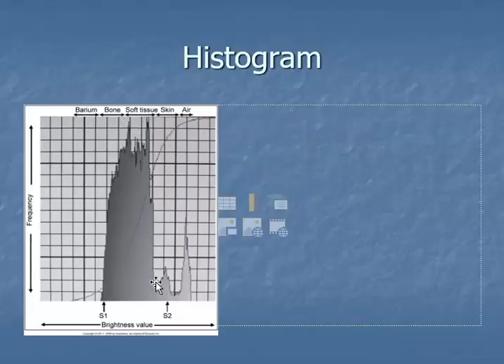So histograms may look like that. Very high exposure, very low exposure across the image. These things just don't make any real sense to us. So what we use to represent a stored histogram is the H and D curve, and you can see that superimposed here. If we have a very vertical H and D curve, that represents a histogram that's very high contrast, as opposed to, let's say, a chest x-ray histogram, which would be much more horizontal.